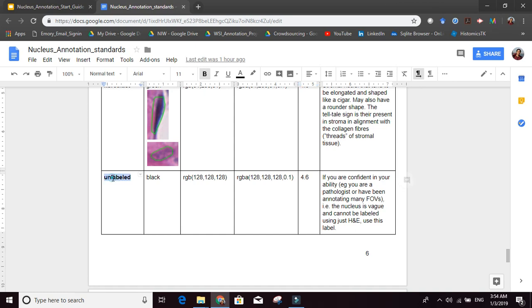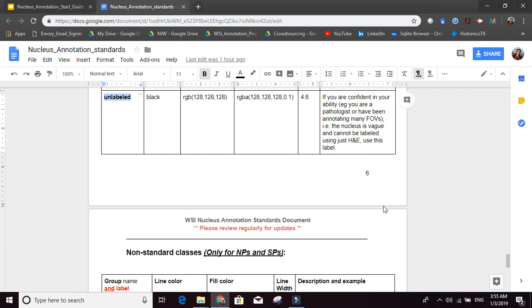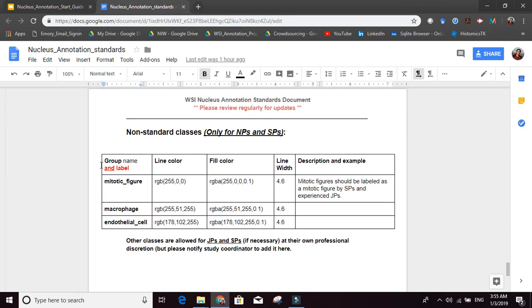Like the label itself is called unlabeled. Don't leave it without adding anything. Add the label called unlabeled. Does that make sense? Copy the word unlabeled itself in the annotation style. There are non-standard classes for the junior pathologists and the senior pathologists, like mitotic figures, macrophages, or endothelial cells.